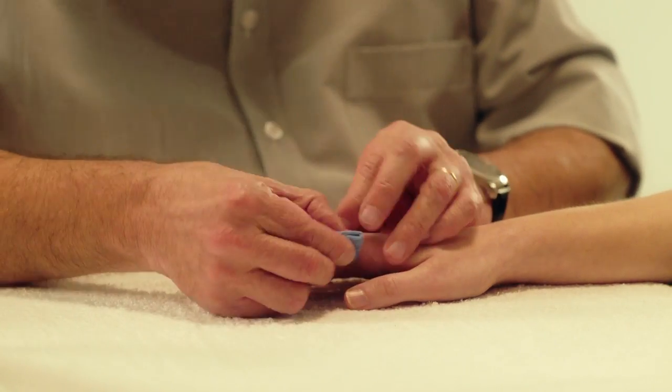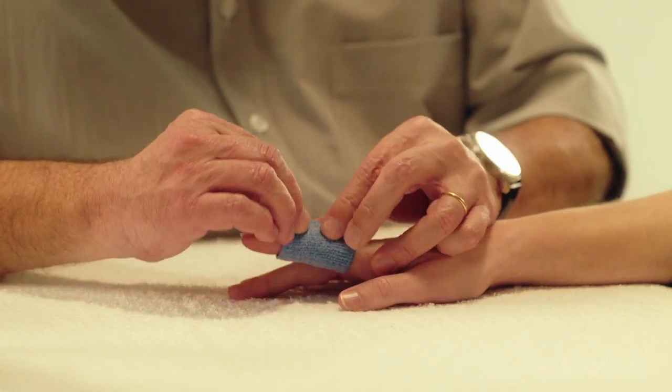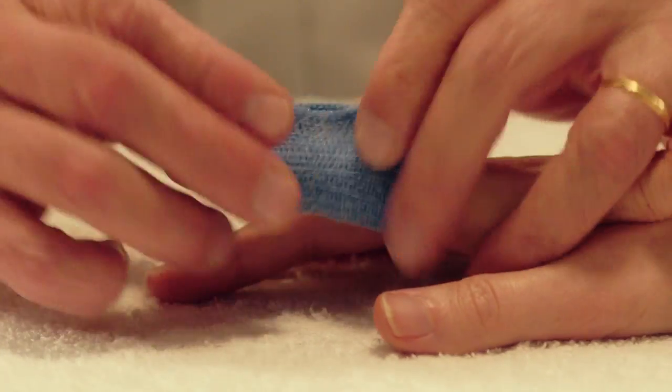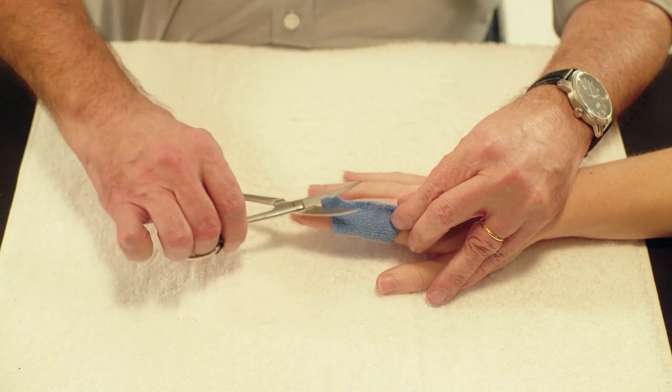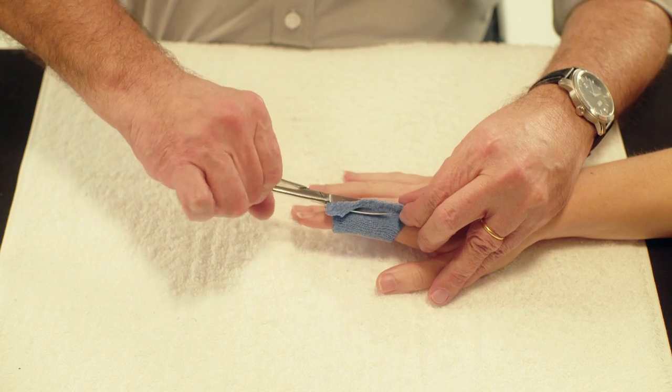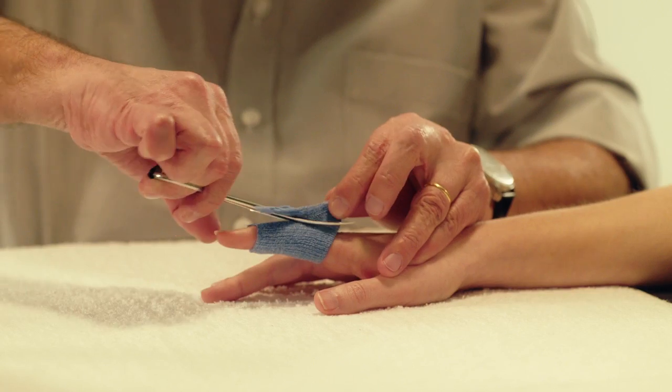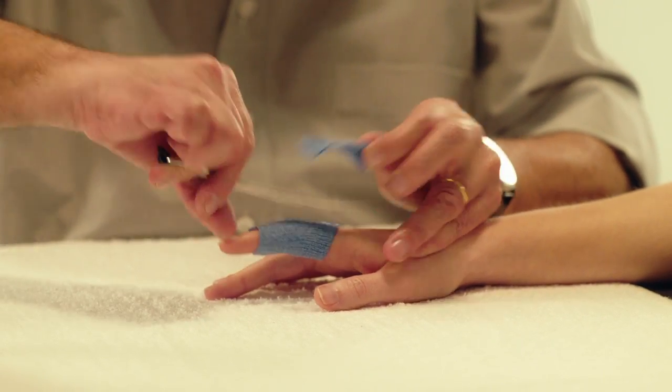Pass the material under the palmar side of the proximal and middle phalanges and pinch it together on the dorsal side. Immediately cut the material with curved scissors as close to the skin as possible. To avoid cutting the patient's skin, pull the material up and away from the patient while cutting.